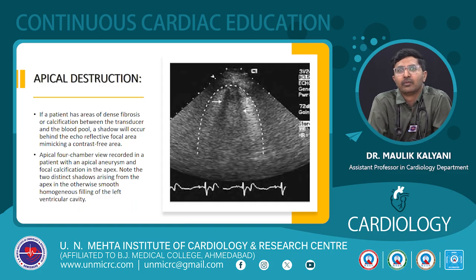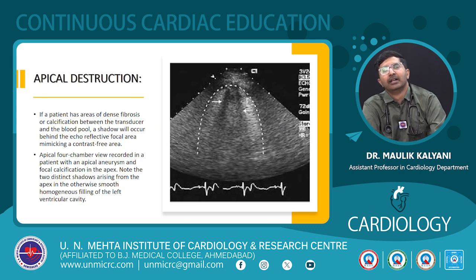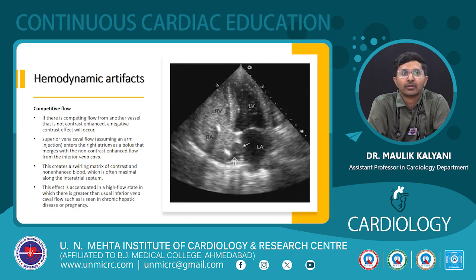As we know, the ultrasound beam cannot traverse this calcified structure. So even if the microbubbles are present near that, they will not resonate because of the decreased intensity because of the calcium. So this is apical destruction.